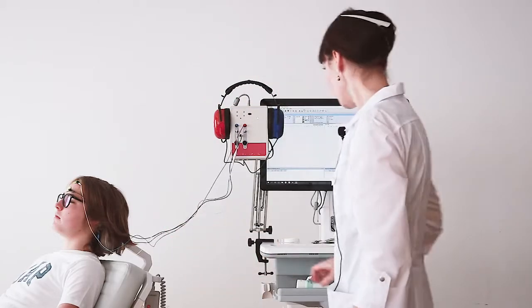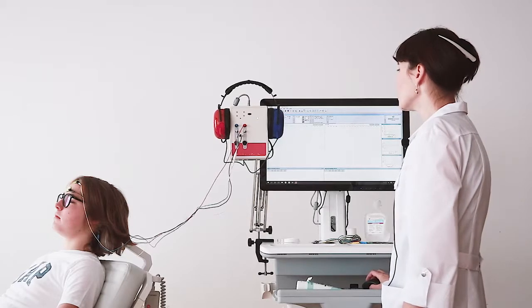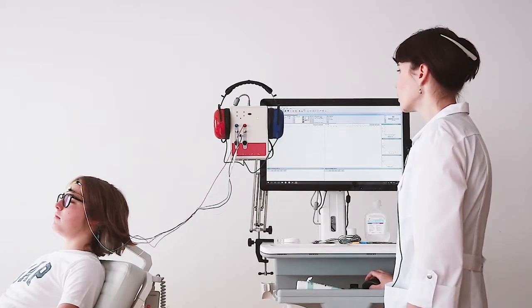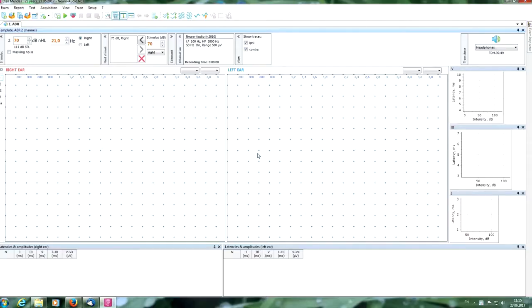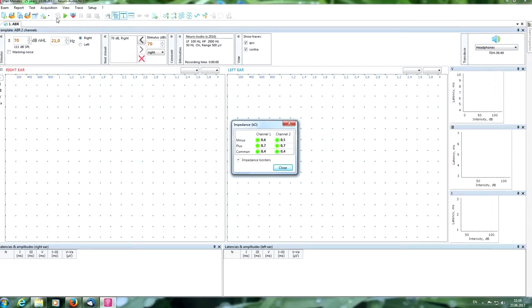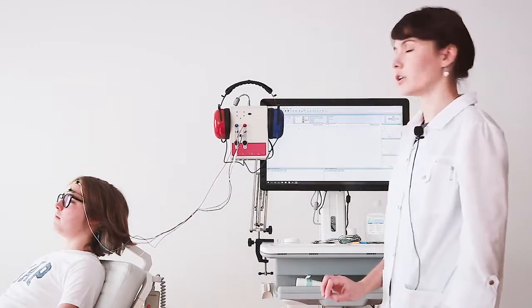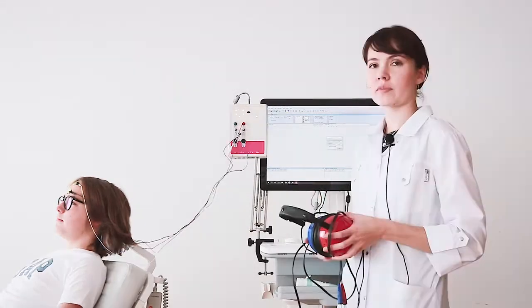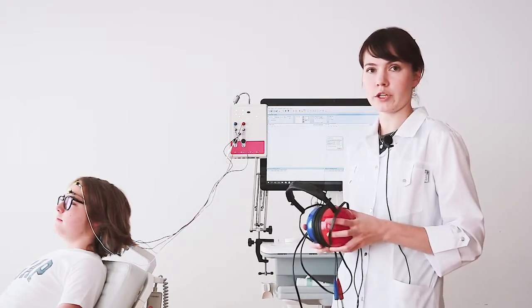After positioning the electrodes, we need to check the quality by pushing the impedance button here in the program or on the main front panel of our amplifier. As we can see, our impedance is good enough. We close this window and now we need to put the stimulator on the head of our patient. In this test, as the stimulator, we will use the headphone stimulator.